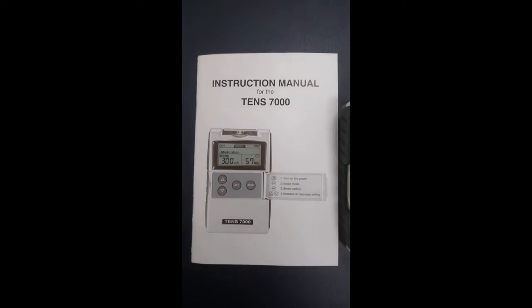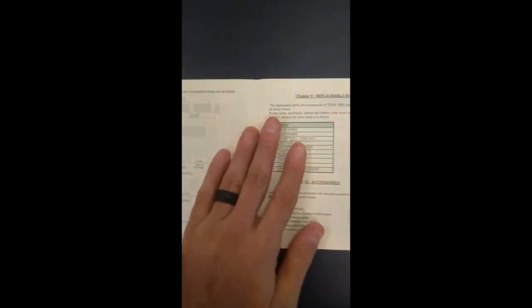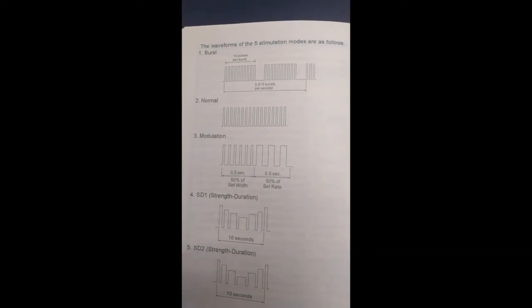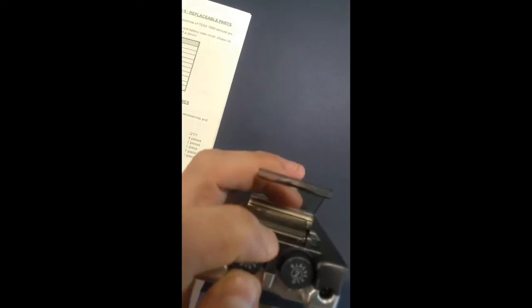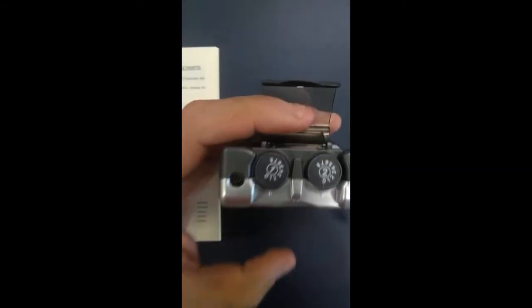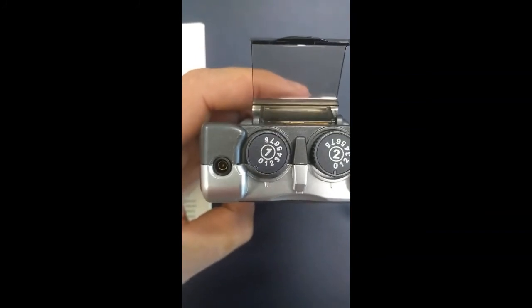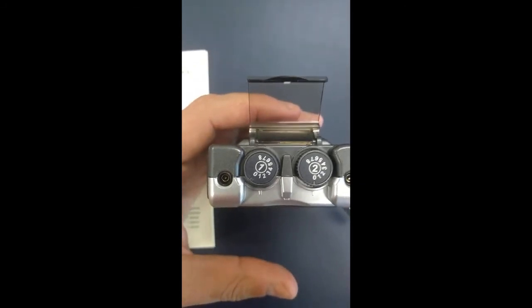Here's a quick video on how to use the portable TENS unit — in this case the TENS 7000. Each different portable unit will have different parameters. This one has five different modes: burst mode, normal mode, modulated mode, SD1, and SD2. To turn the machine on, flip it open and rotate the dial slightly. The dial goes zero through eight; each number represents 10 milliamps, so a setting of eight equals 80 milliamps.